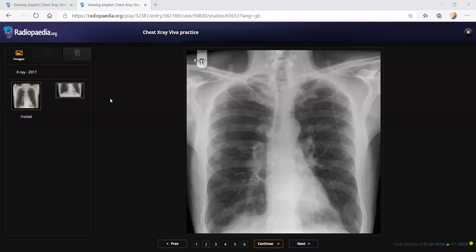So in my usual practice, I like to look further. There is some bilateral paravertebral swelling I can see towards the lower margin of the film, which is centrally placed. So I'd like to go for further imaging for better characterization.